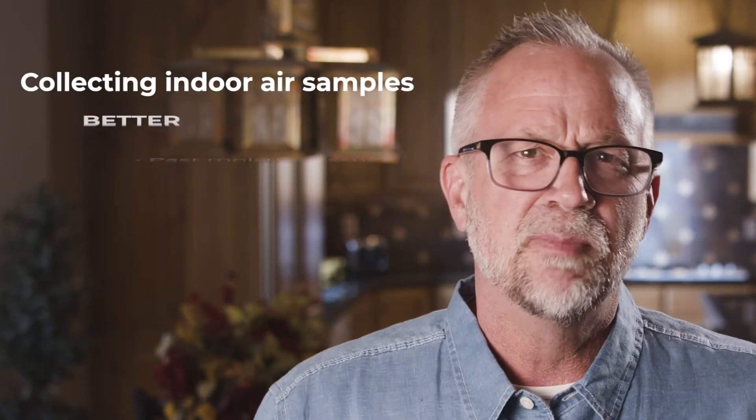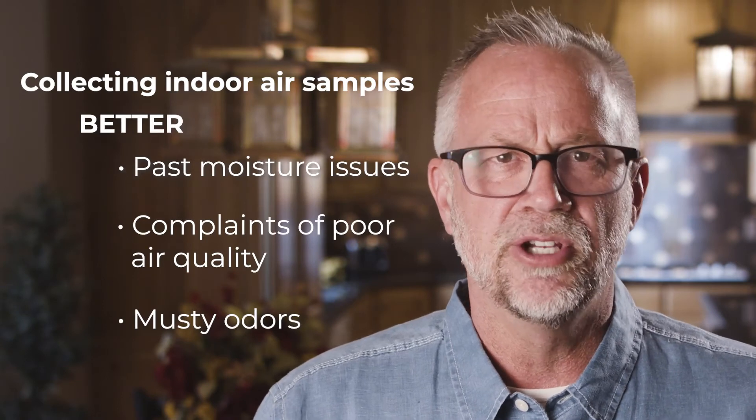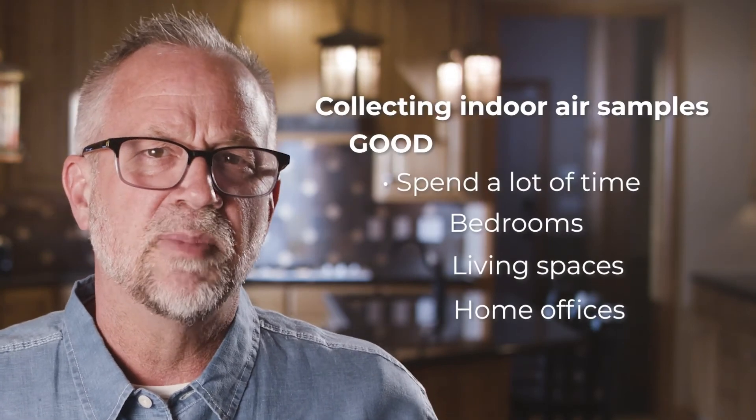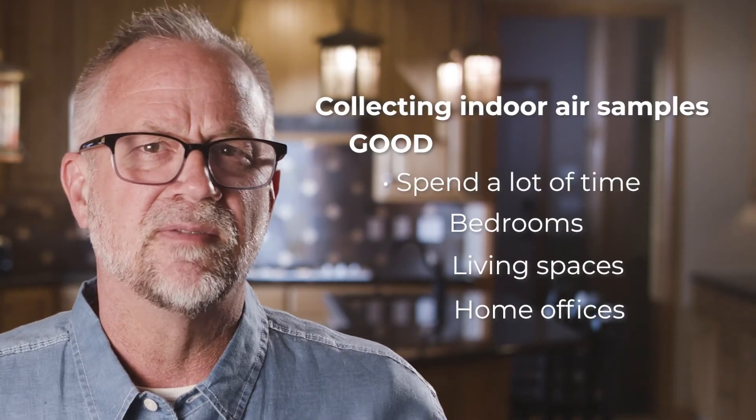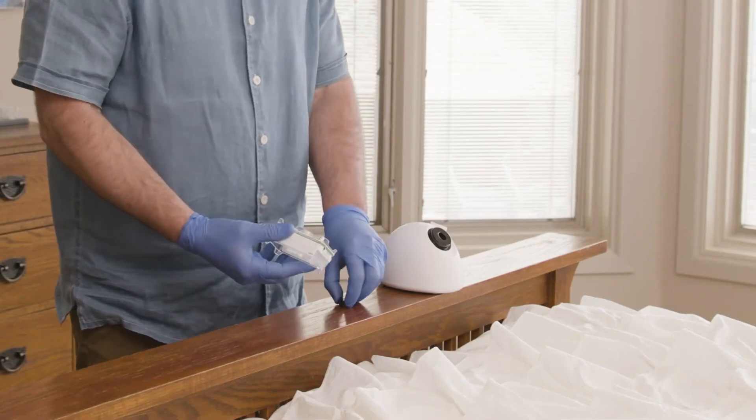If there aren't any active moisture issues or visible mold growth, the next best sampling locations are areas with disclosed past moisture issues, areas with complaints of poor air quality, or areas with musty odors. If there are no obvious locations, then good areas to sample in are where the occupants spend significant amounts of time, such as bedrooms, living spaces, home offices, etc.